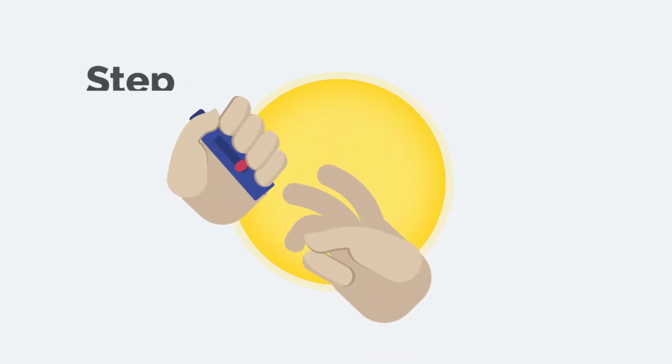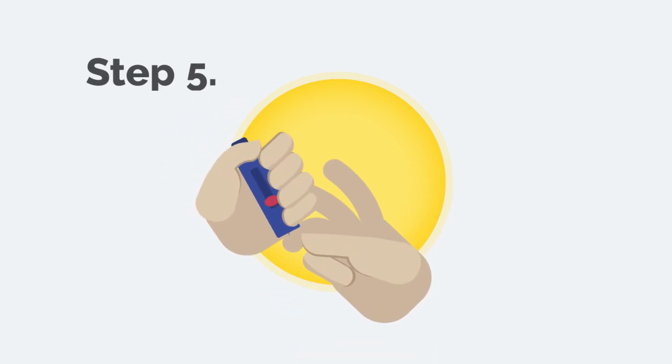Gently squeeze on the finger you will test and press the lancet device. Not too hard, not too soft. Onto the side of your finger, it's less tender than the tip. Press the button to launch the lancet.